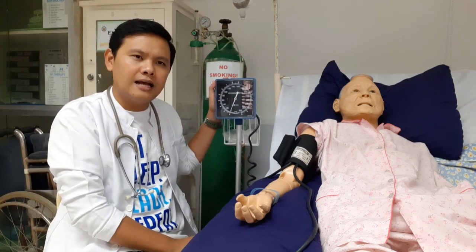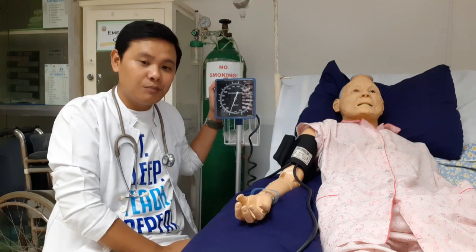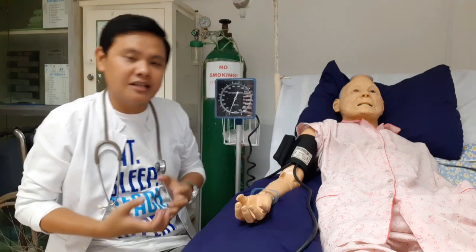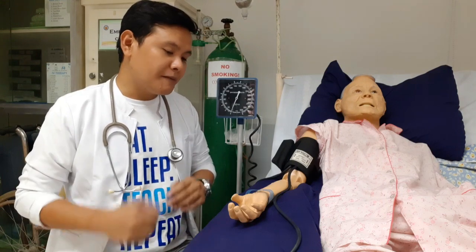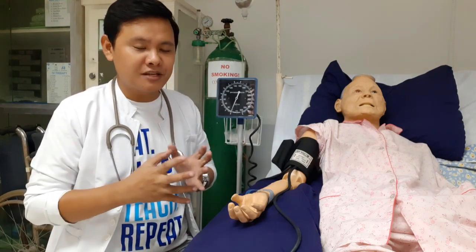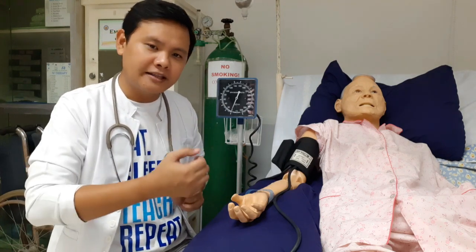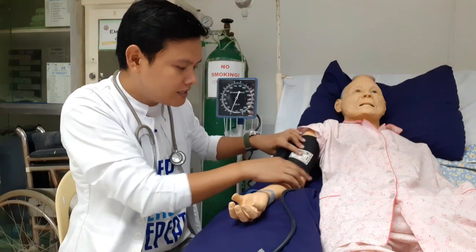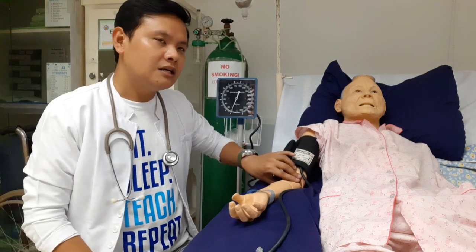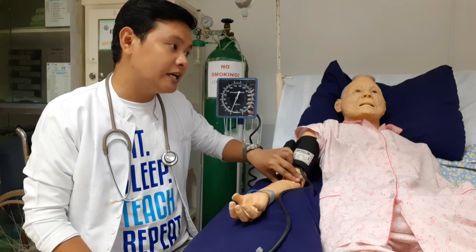So, it's really important na alamin natin or perform natin yung tinatawag natin preliminary palpatory determination of the systolic pressure. So, paano natin ginagawa yun? How can we perform a preliminary palpatory determination of our systolic pressure? Simple lang. First one is you have to locate the brachial artery. Nasabi ko naman sa inyo that usually ang brachial artery po ay makikita ninyo sa may gilid. Try to palpate and locate the brachial pulse. Kung naramdaman mo na yan, that's a good one.